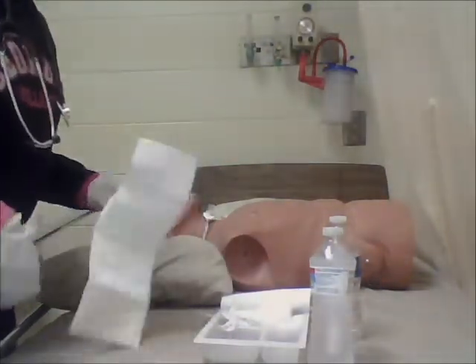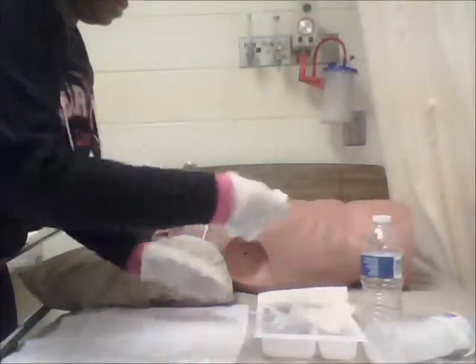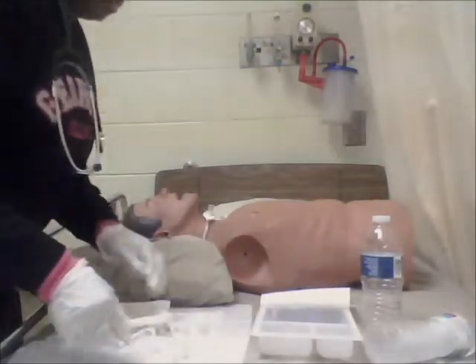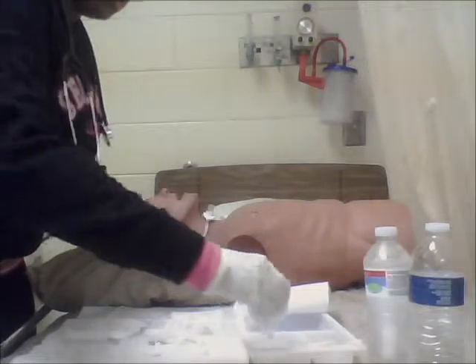I'll go ahead and pull out my trach equipment. Okay, I'm going to pour sterile water in one side of the trach, and then hydrogen peroxide and sterile water mix. Go ahead and place some of my Q-tips in the sterile water and some in the mixture. I'm going to get a piece of gauze, dip it in the hydrogen peroxide sterile water mixture.